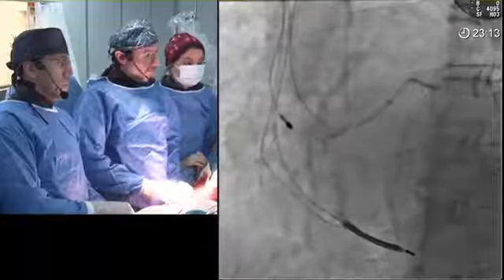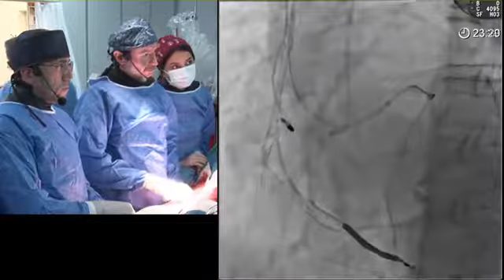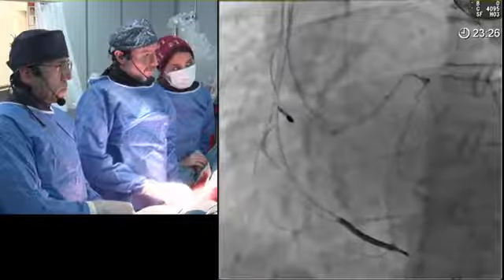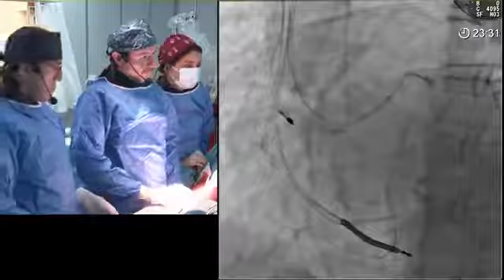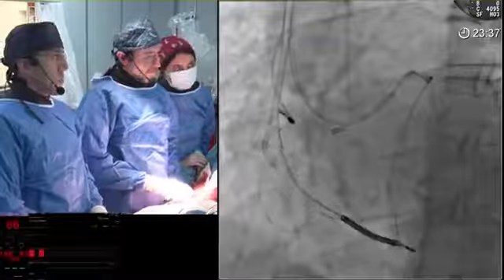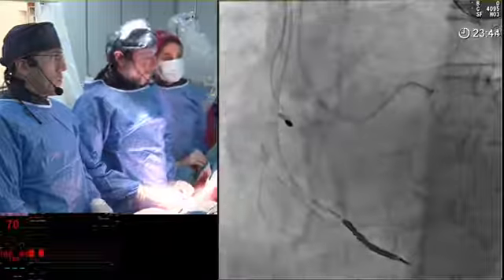That's one principle. Second, here he knows for sure there is vessel structure proximal. I would definitely do an injection there, because maybe you have a channel, you want to discover what's going on. If it starts a dissection, then you push, make a dissection, and then you go in there and put more contrast. So you define where we need to play. Because here you don't know. You want to make sure that you have a vessel structure there. And then from there you can use a stiffer wire.